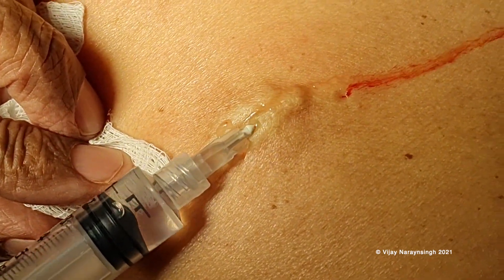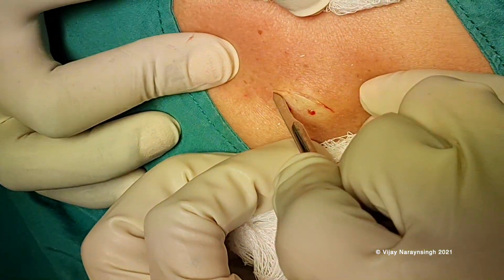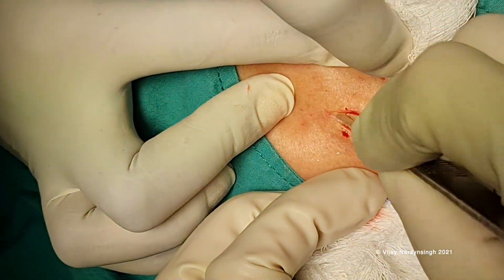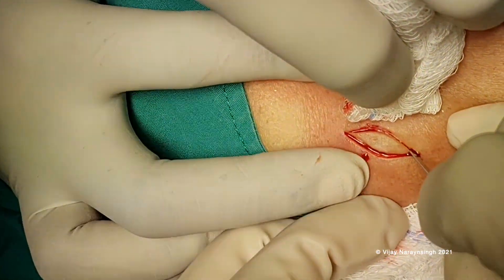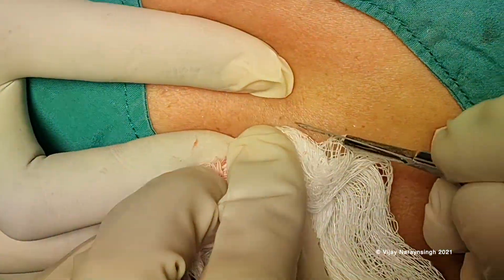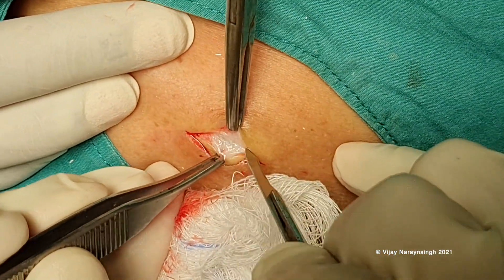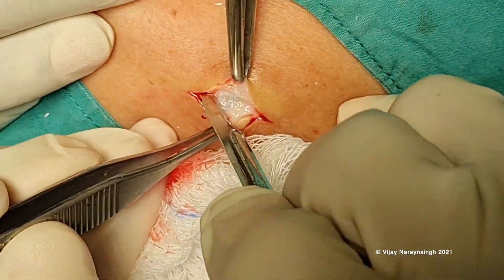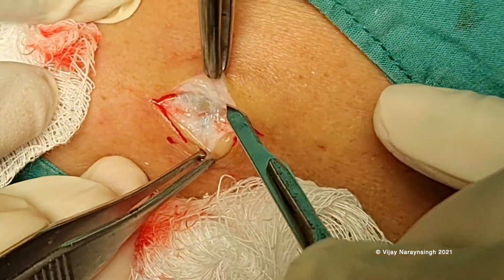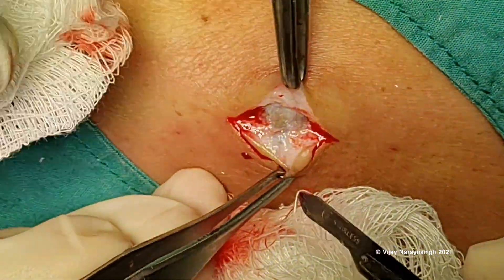Because the cyst wall is often thin and will rupture in many cases, we could make a decision to do a controlled rupture. In this, we dissect very carefully the top half, the superficial half of the cyst from the skin. This is done by sharp dissection and we expose the upper half. Now to get to the lower half, because it is deeper and wider, we are likely to rupture.